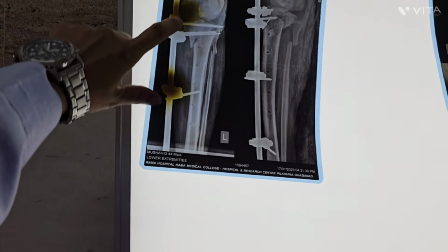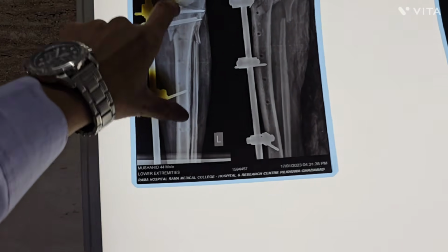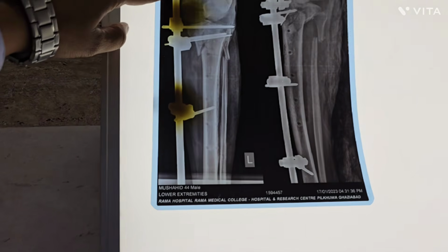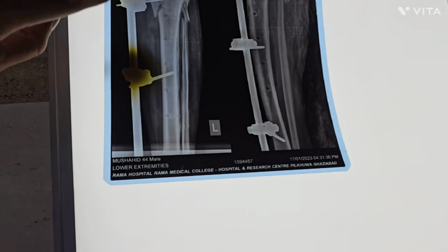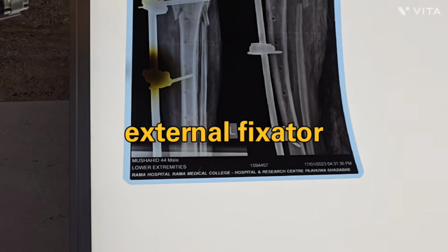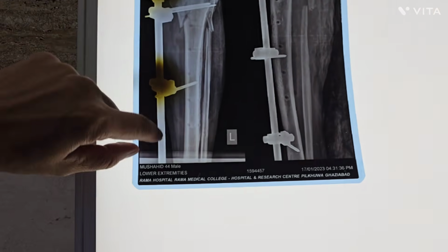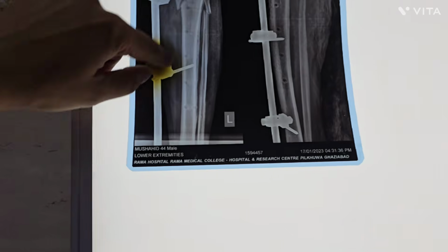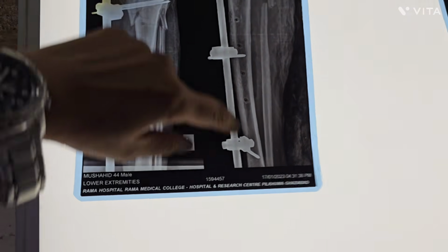Now this one is a unique patient. In this X-ray you can see the tibia, distal femur, fibula, and this structure. This is a rod-like structure. It's called an external fixator. This is the tube-like rod, and this one is a Schanz screw. This Schanz screw goes inside the tibia, and this one is the clamps.